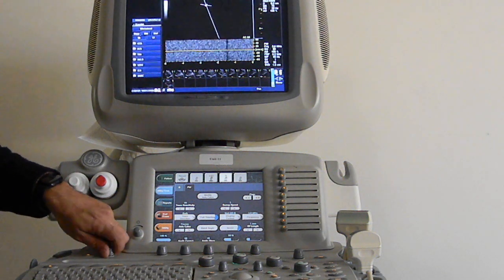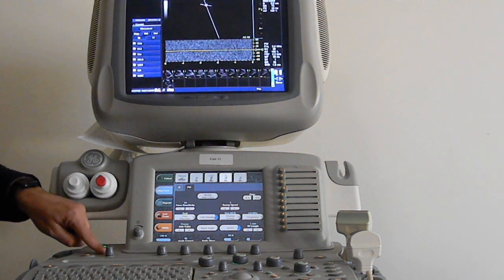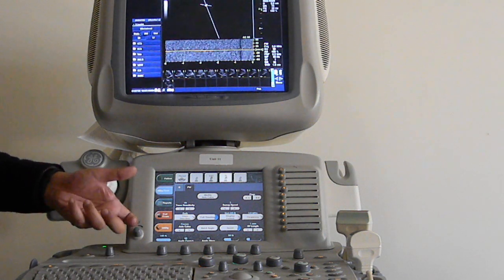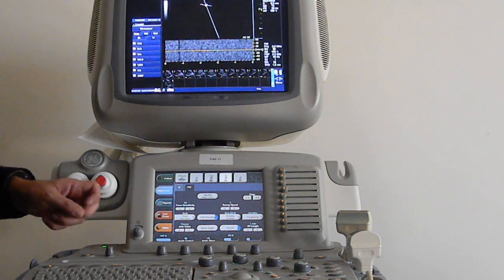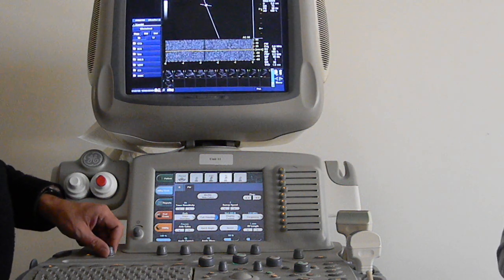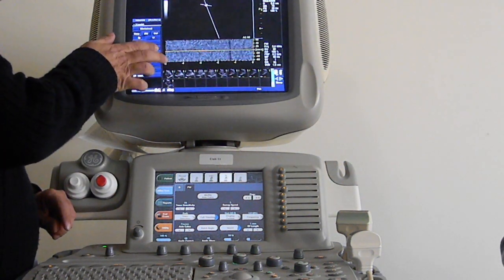So we can turn off the volume, that's the volume of your speakers. Here there is a button, mute it down, so you'll be able to hear what I'm saying without me raising my voice. You guys, what happened to Mike? He just turned angry.